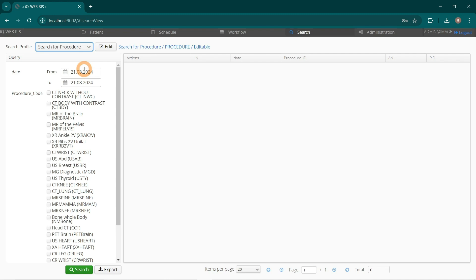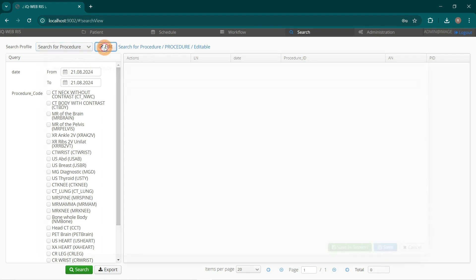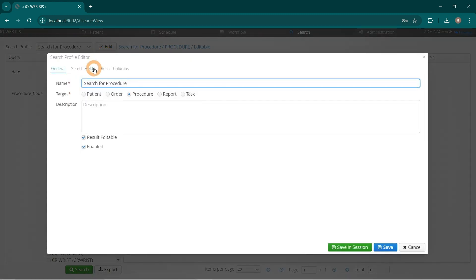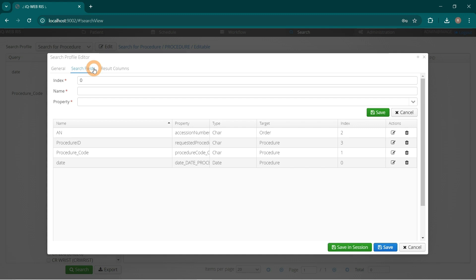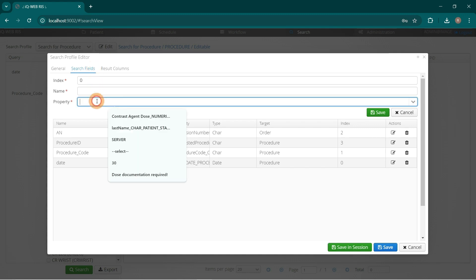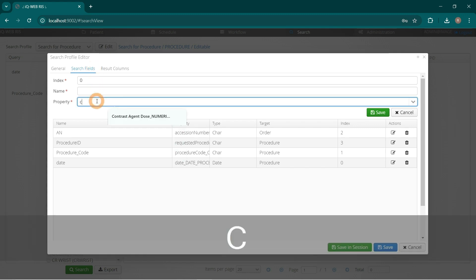Select Edit button next to Search Profile Name. Go to Search Fields tab. Search in Property for Contrast Agent Dose.